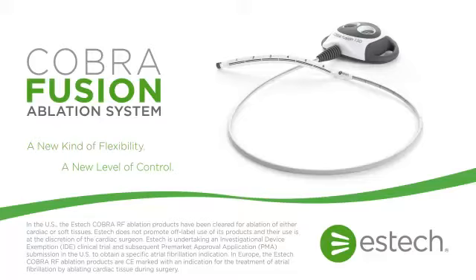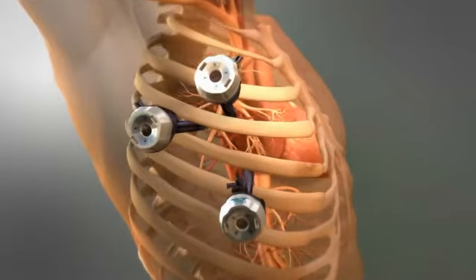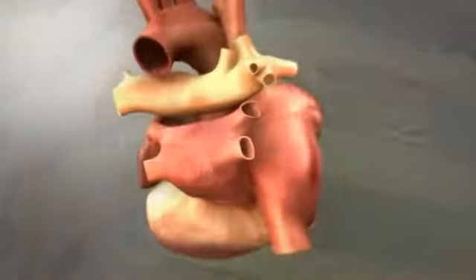The ESTEC-COBRA fusion can be used in stand-alone or concomitant cardiac ablation procedures to safely create continuous, transmural lesions. When used in a stand-alone ablation, the surgeon places three ports on the right side of the patient.